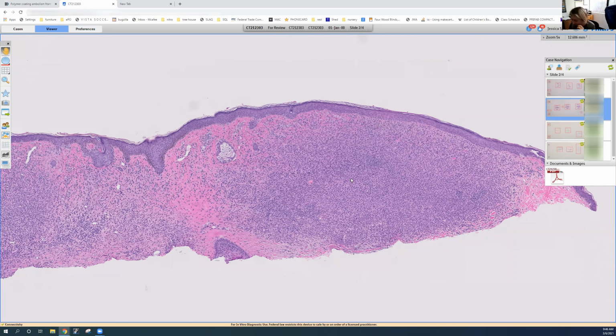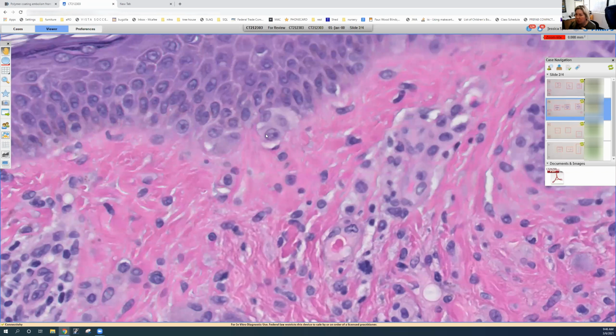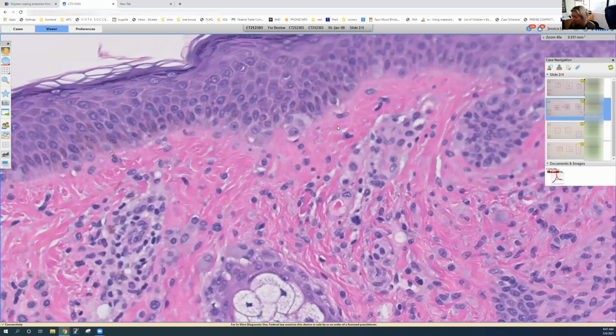So the current WHO terminology classifies these on a spectrum, with lesions such as these with mostly nevoid looking cells and minimal atypia as BAP1 inactivated nevi, and those with larger numbers of these big epithelioid or spitzoid looking cells as BAP1 inactivated melanocytomas. Melanocytoma meaning we don't really know how this is going to behave, but we can't call it melanoma.